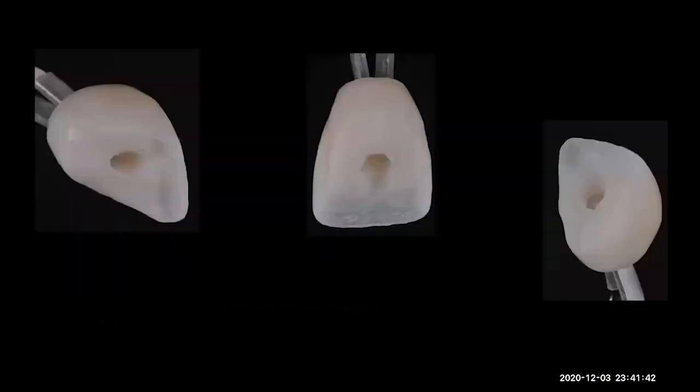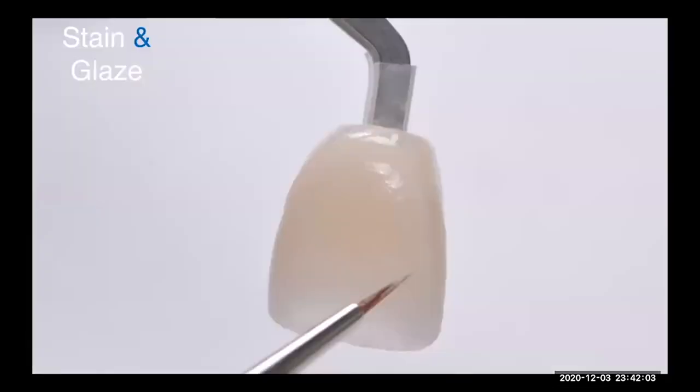You see, we can do it little by little. At this point, it was a long time ago that I did this case. So we are doing it little by little with a nice instrument, like a lentil shape. I've been doing my concavity calibration until I get the point that I like.